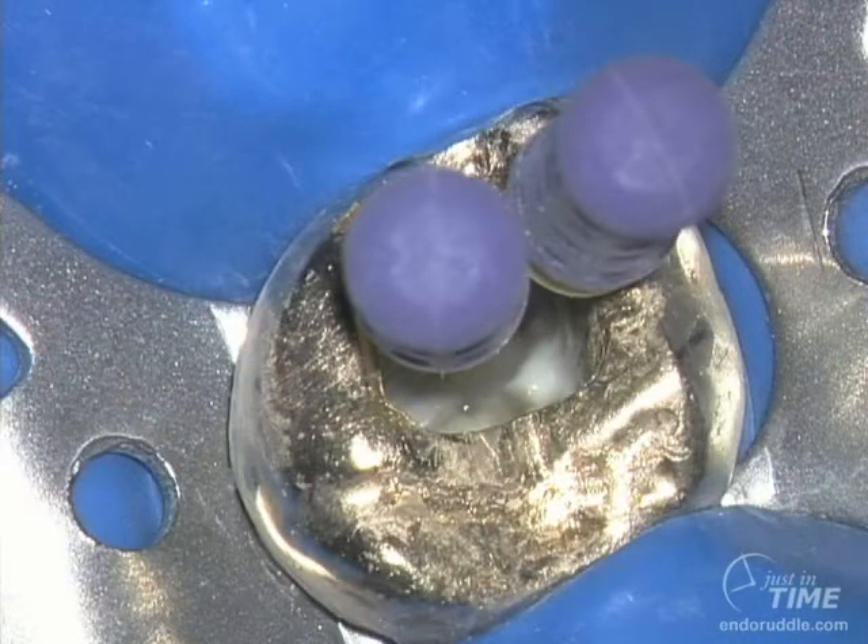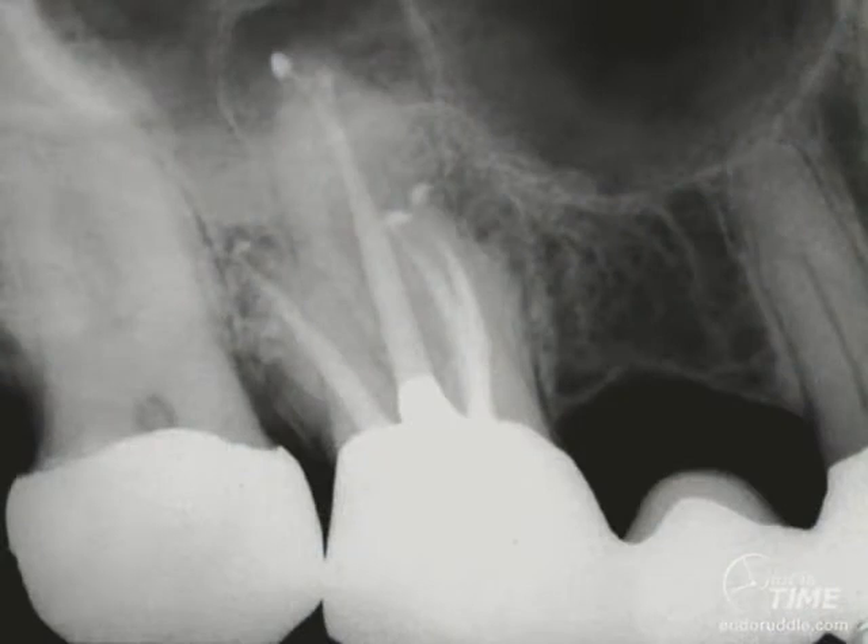Without much more effort, the instruments are probably close to the full working length, and the instrument handles are observed to be standing up straight and tall. In the postoperative film, you can see that there's an MB1 and MB2 that have been cleaned, shaped, and packed. About 93% of all maxillary molars have two systems in the mesial buccal root, and about 40% of that 93% have two systems that are separate over their full length and end in two or more separate apical portals of exit.